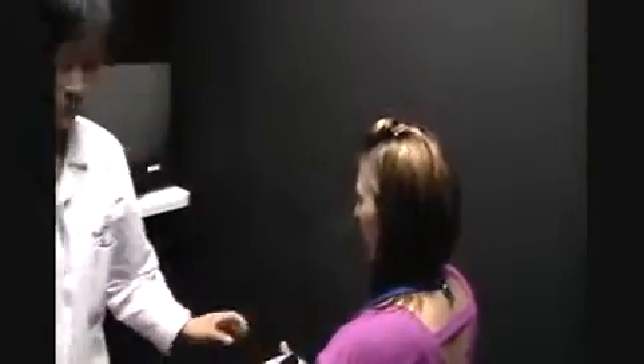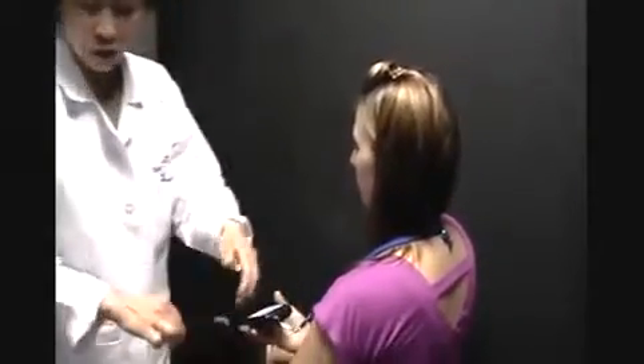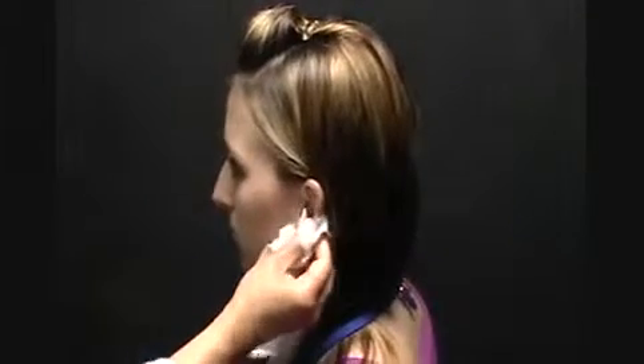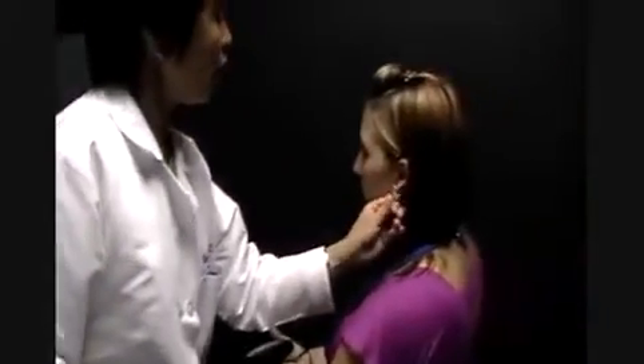She is seated four feet away from the screen, and we're going to start with the ground electrode, which is on her earlobe. We're going to clean her earlobe with an alcohol pad. We're going to abrade the skin just a little bit by rubbing it with a tissue, and we're going to use this gel. This is the same thing as EKG gel.